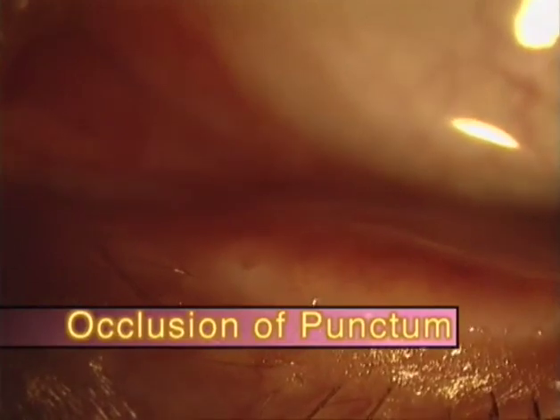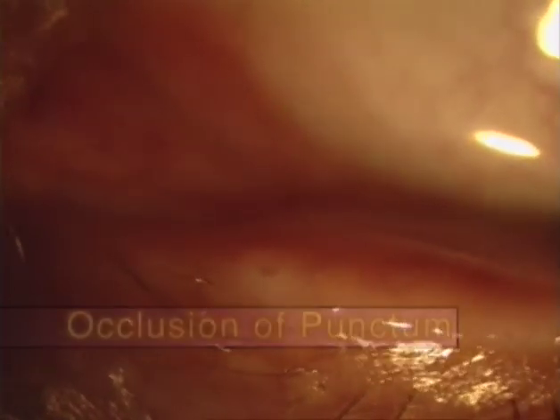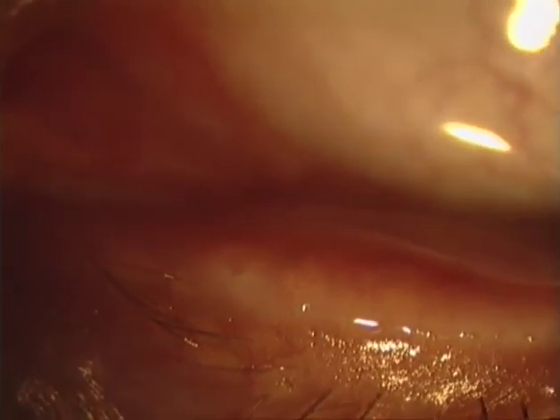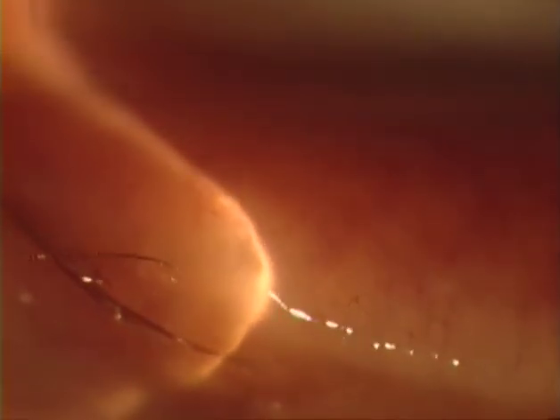In this case of occlusion, the punctum itself seems to be normal at first glance. But on closer scrutiny, we find the epithelial lining hazy, as if covered by a veil. Furthermore, we see tiny capillaries running across the punctum. And in optical section, the obstructing conjunctival epithelium can be seen directly, as an intact layer.